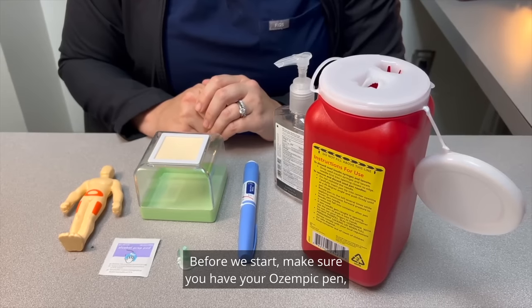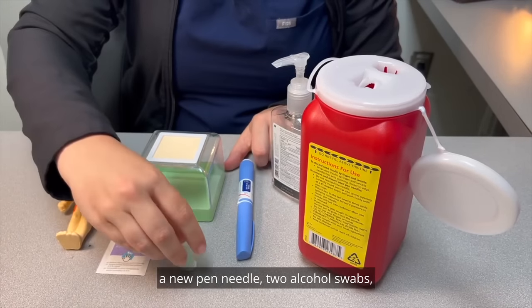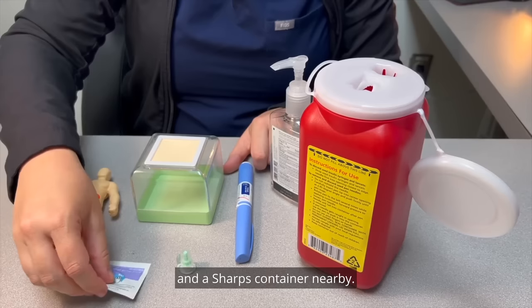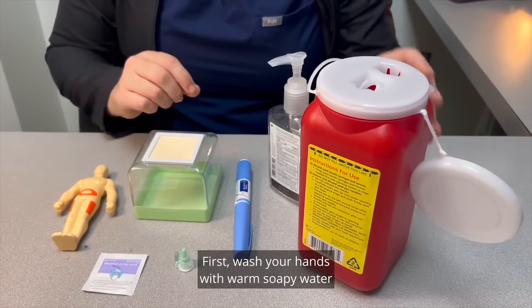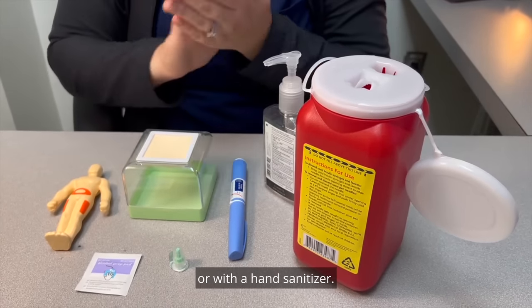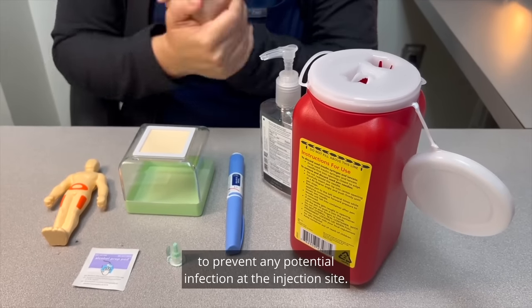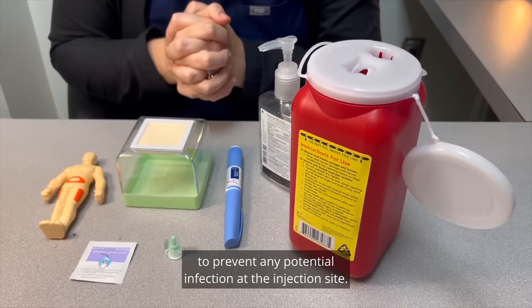Before we start, make sure you have your Ozempic pen, a new pen needle, two alcohol swabs, and a sharps container nearby. First, wash your hands with warm, soapy water or with a hand sanitizer. It is important to ensure your hands are clean to prevent any potential infection at the injection site.